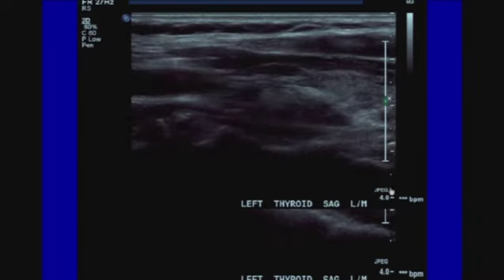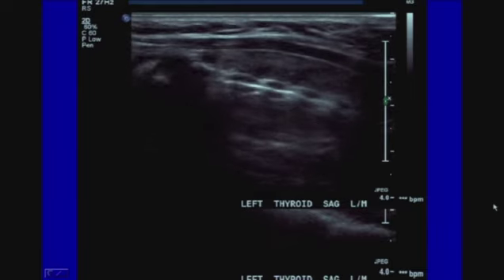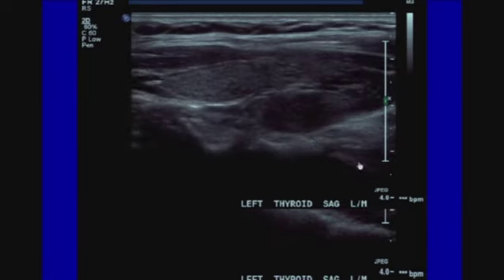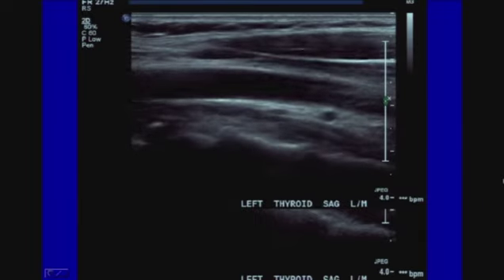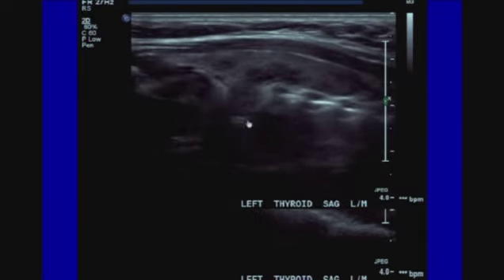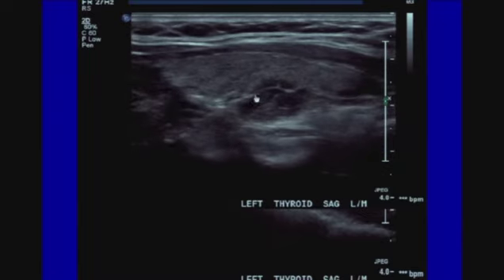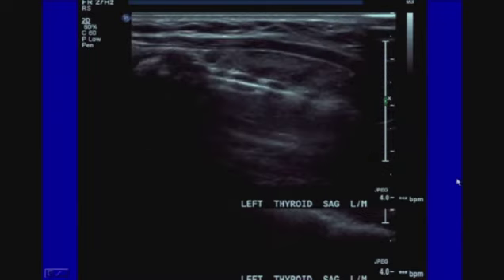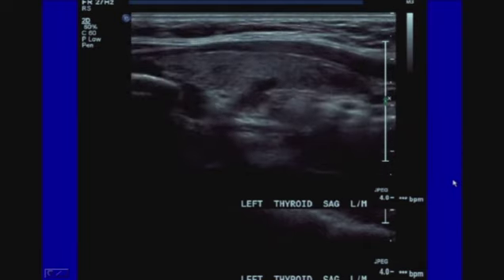In this particular individual here, the appearance of this sort of patchy hypoechoic area on still images could mimic a thyroid nodule, but I could see this cleft just running right on top of that. This is just part of that cobblestoning pattern, which is really all throughout the gland. And on a static image, this could simulate a pseudonodule, but the ability to see the entire gland and appreciate this as a field effect is very helpful.